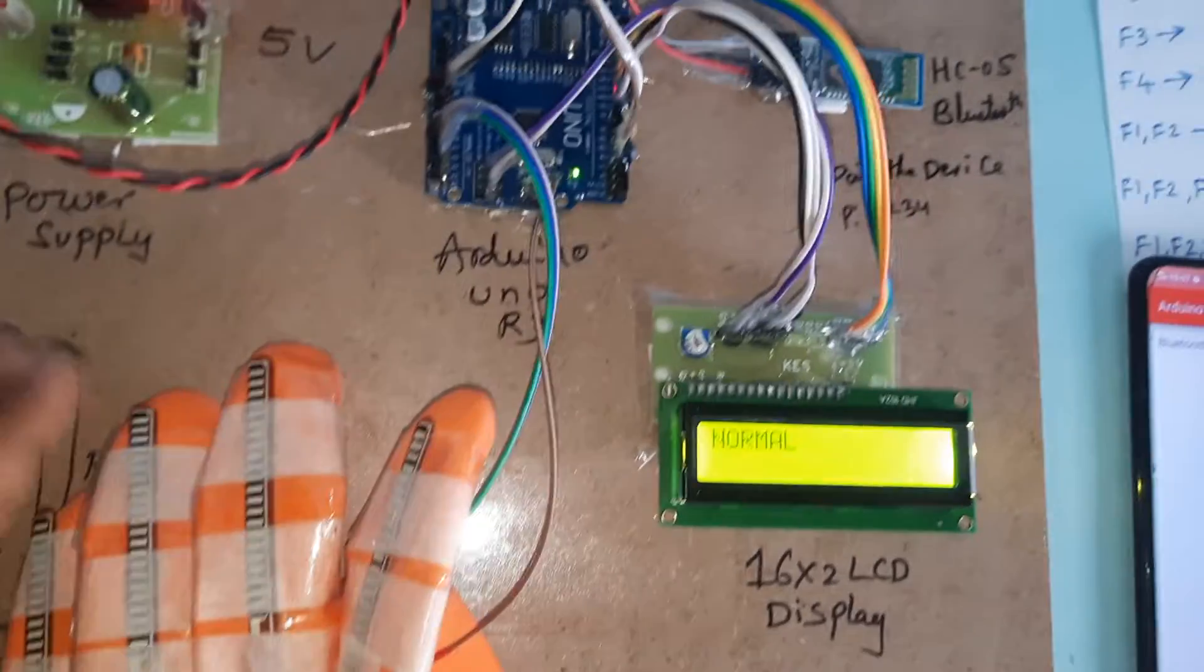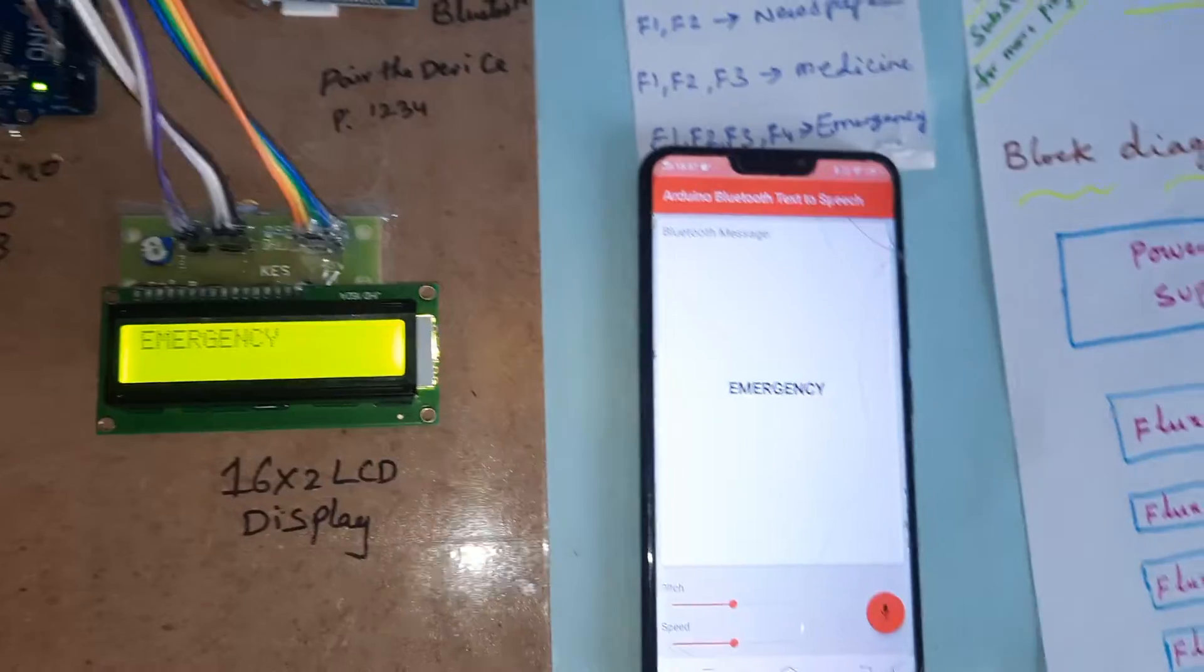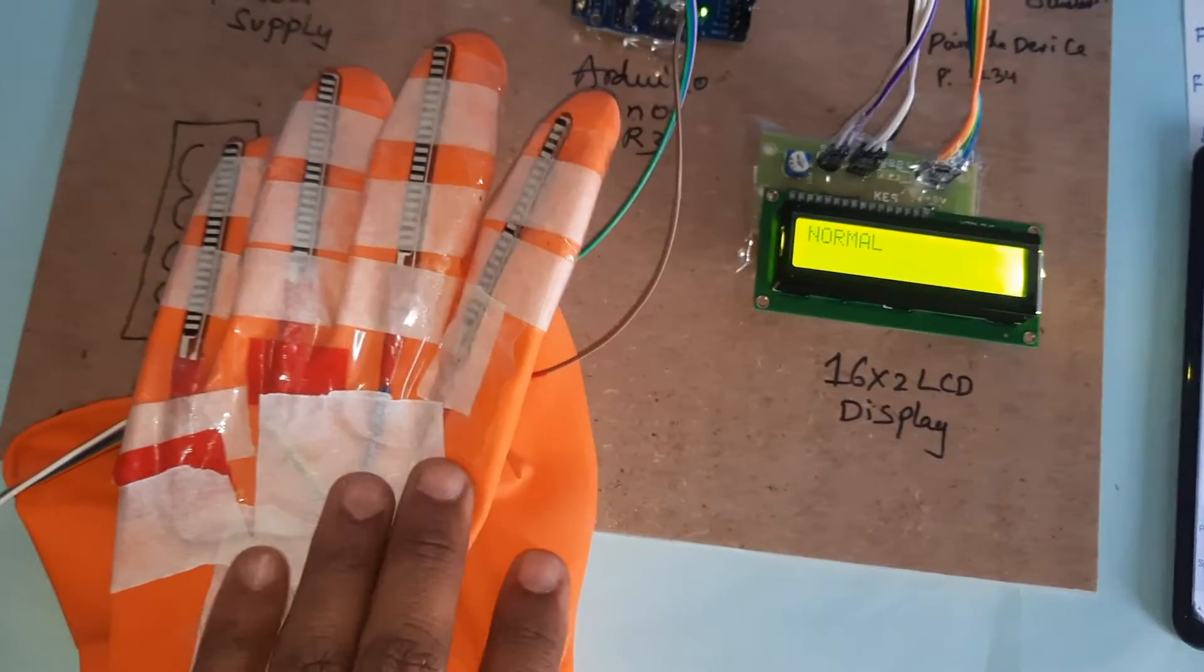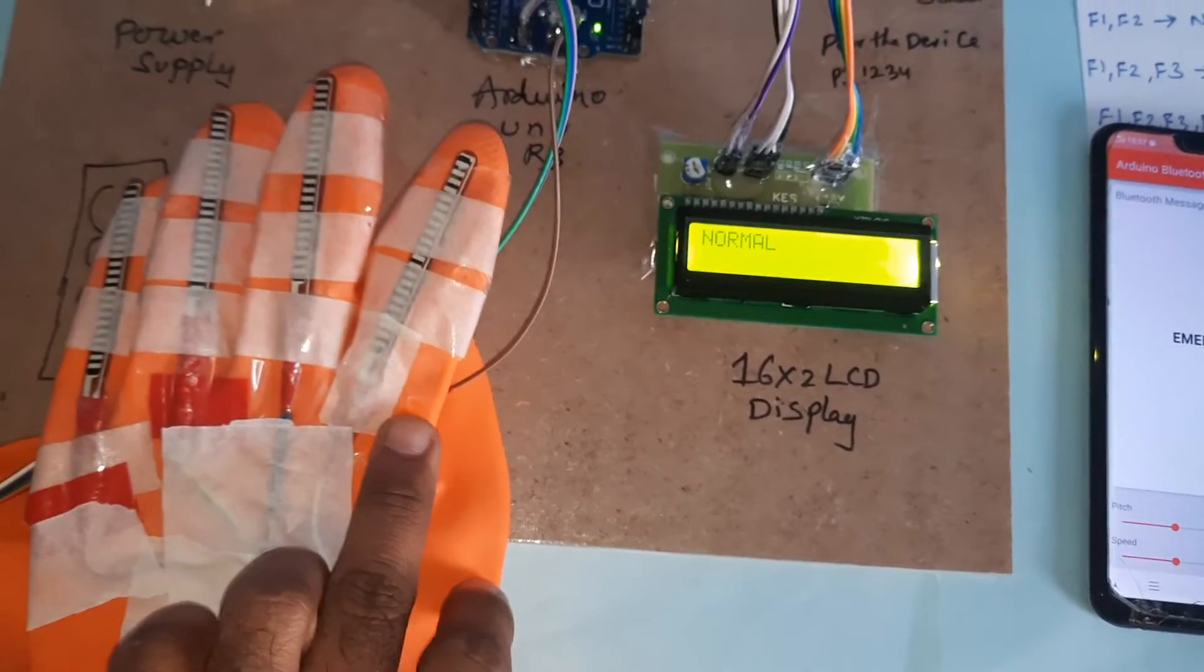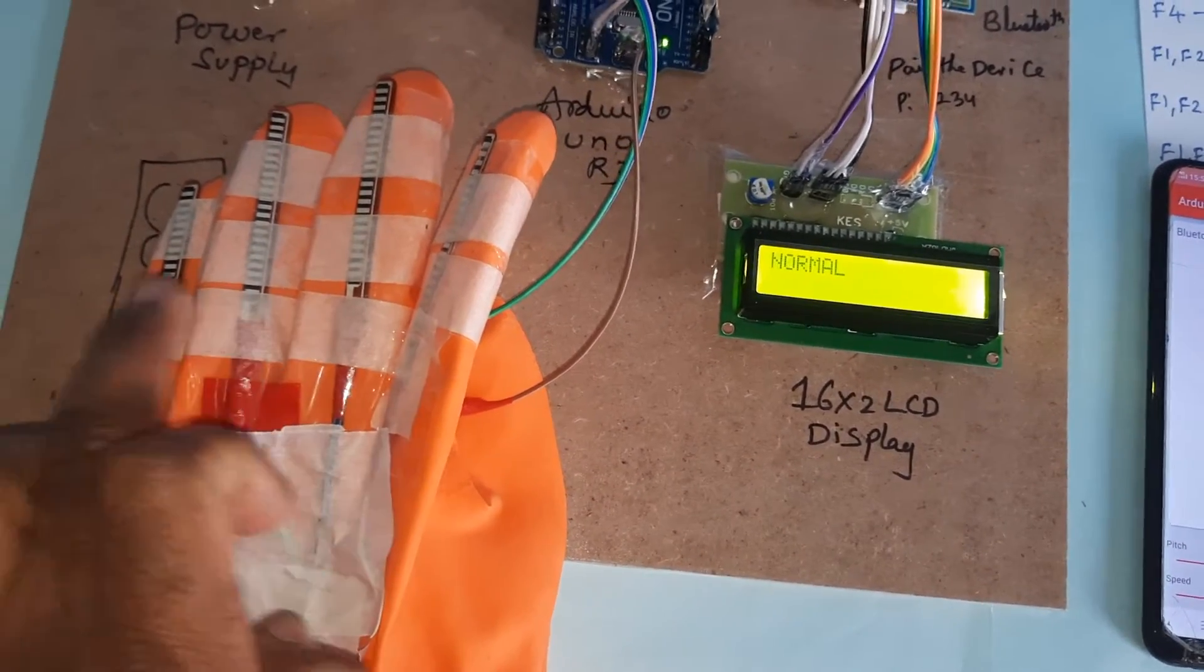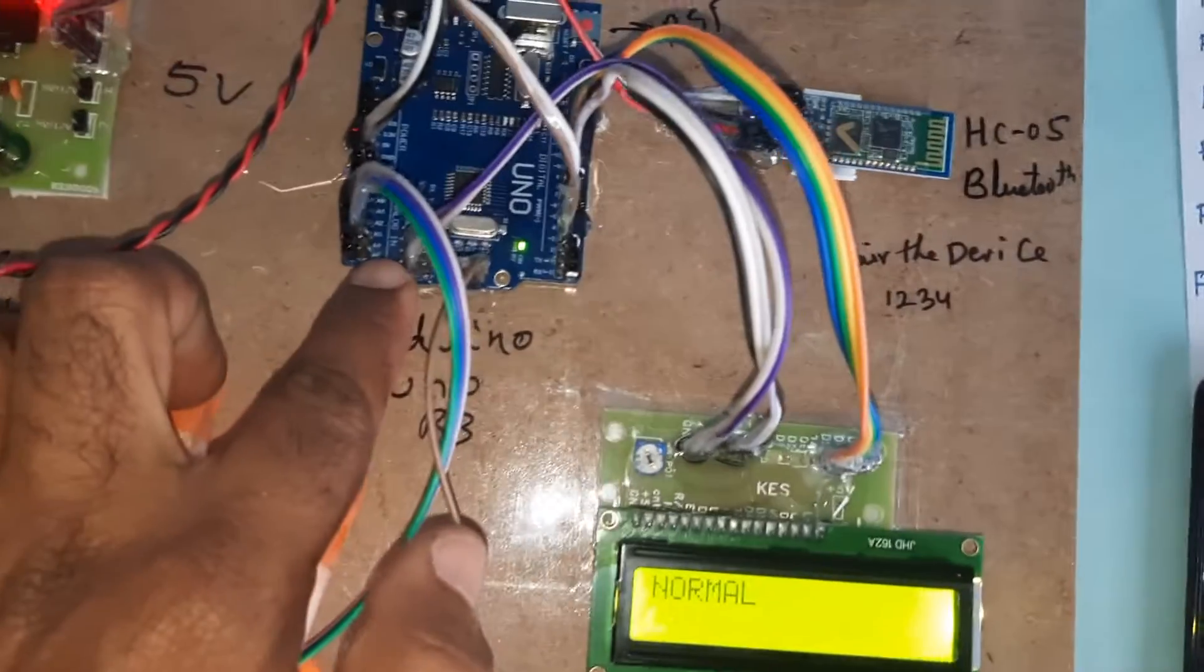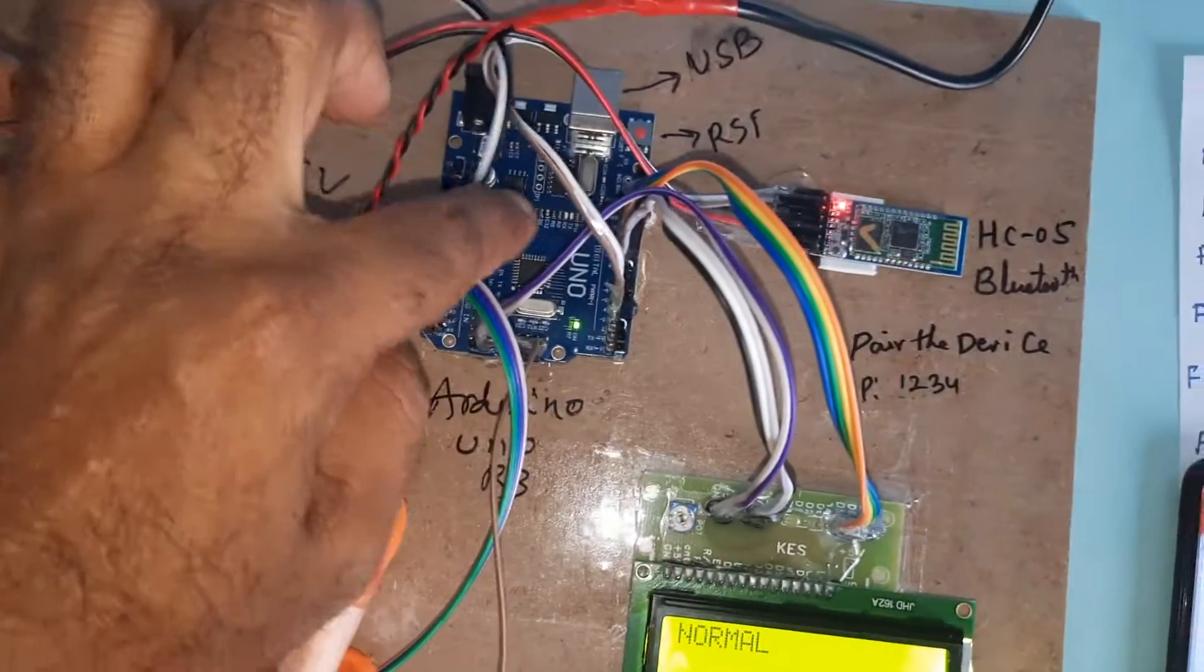These are highly sensitive flex sensors, 2.2 inch flex sensors. Those are connected with A0, A1, A2, A3. Four flex sensors are connected to A0, A1, A2, A3.